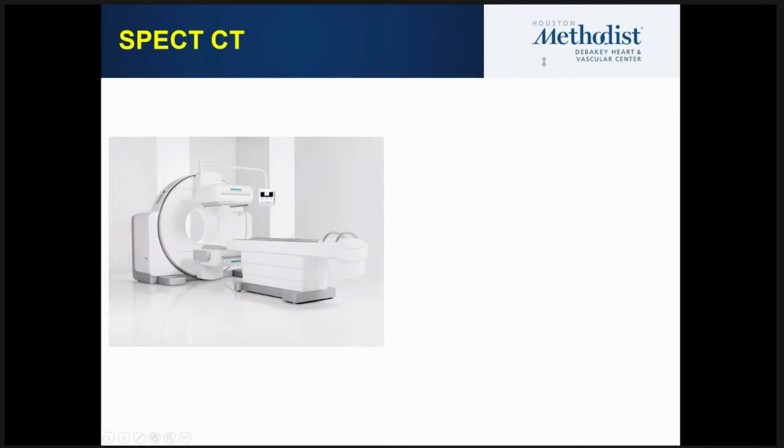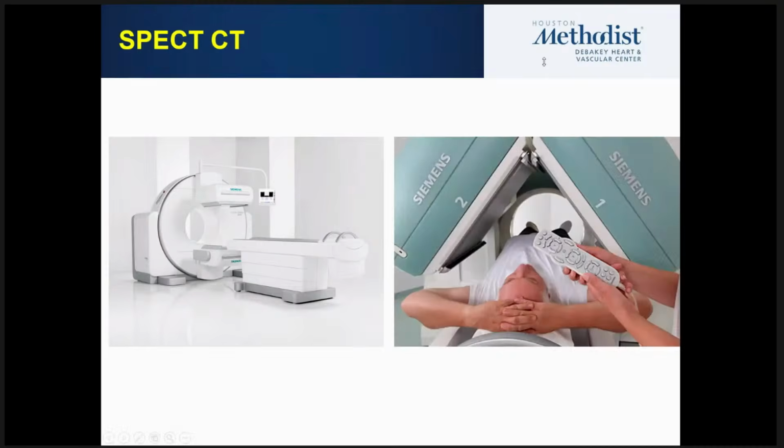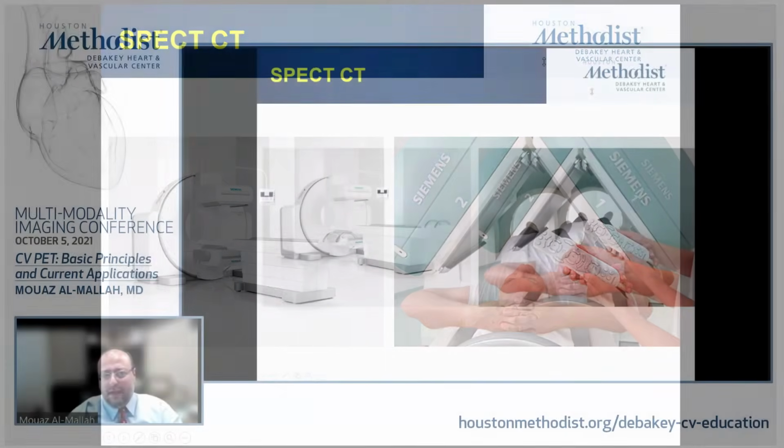They are usually around the patient. We inject the patient with a radiotracer and we take pictures. Now, usually the detectors are around the patient, but only half the way. So the patient will have two detectors that are 90 degrees apart or so, and they rotate around the patient.